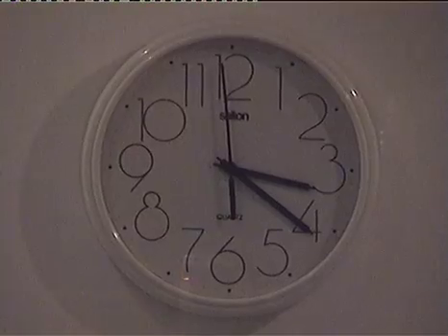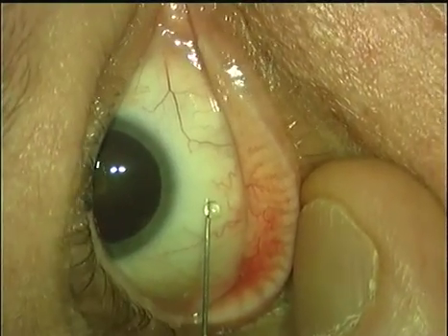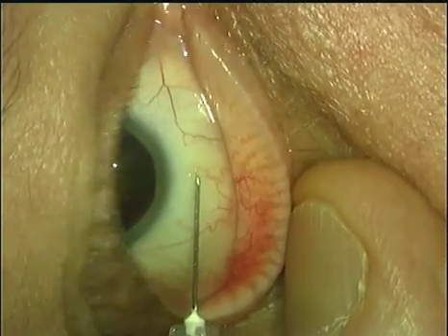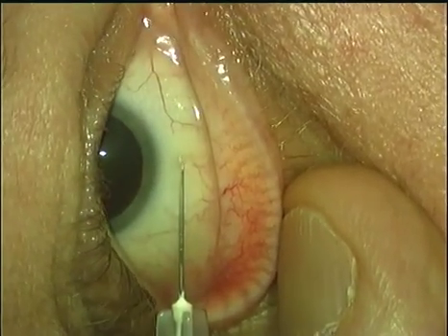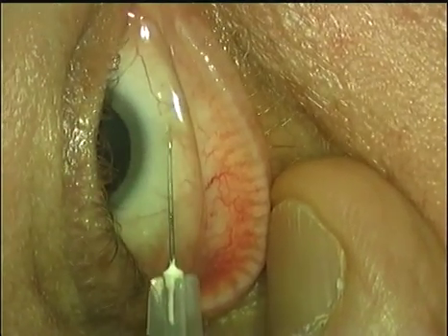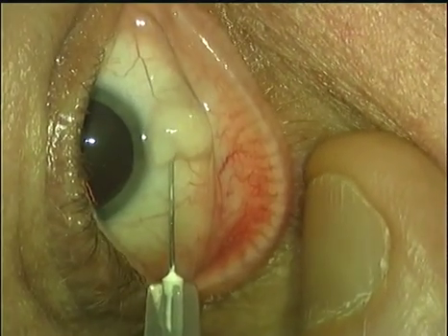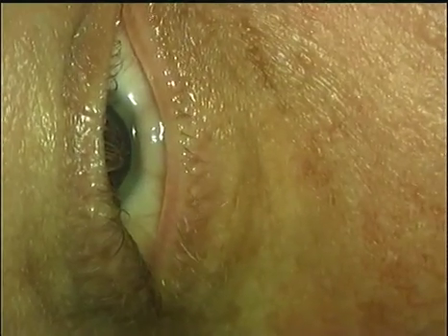Using a 27 or 30 gauge needle we then approach the eye from the lateral side, and the needle has to be strictly in the horizontal plane. When we commence our training it's terribly important to avoid the risk of a scleral puncture, and we raise a small conjunctival bleb. The needle is then withdrawn.